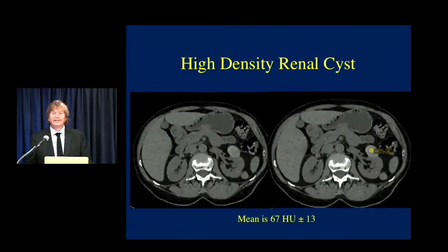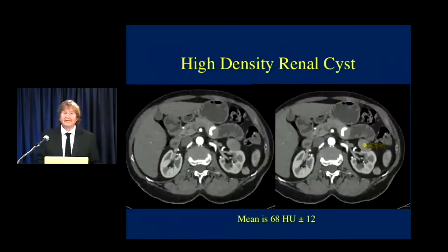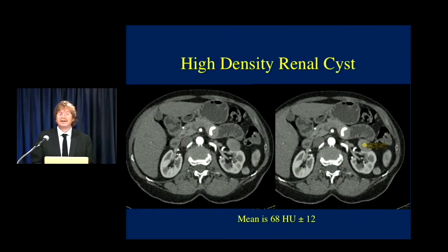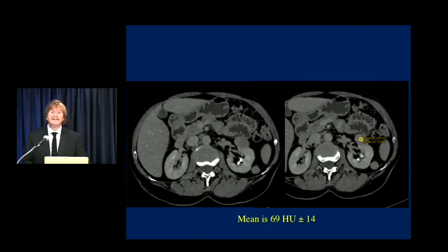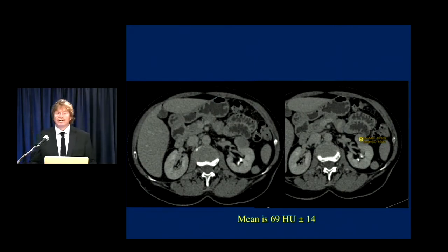When you give IV contrast, a high-density renal cyst does not change its attenuation. Here's an example: a lesion in the left kidney measures 67 Hounsfield units on non-contrast. On contrast, it measures 68, and on delayed phase it's 69 — it does not change attenuation. That is classic for a high-density renal cyst. If you only had the contrast phase and saw a mass measuring 68 Hounsfield units, you might call it a papillary renal cell carcinoma. With non-contrast, arterial, and delayed together, you see a benign lesion. Without non-contrast, you might have resected that lesion.